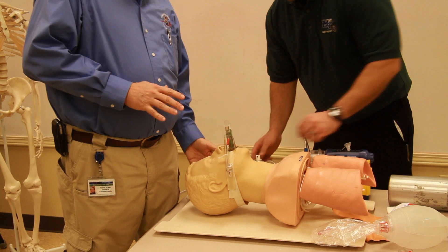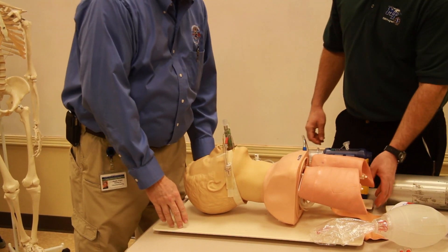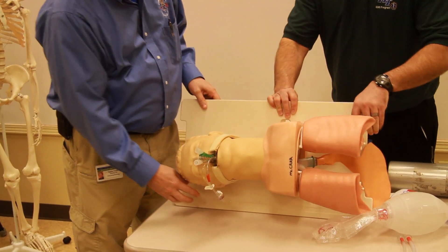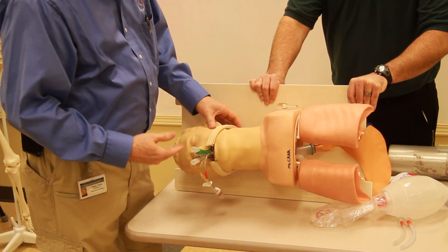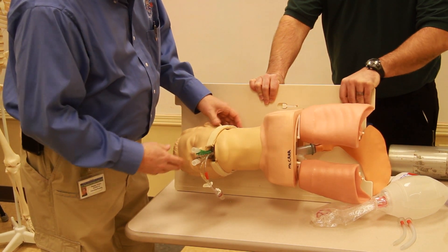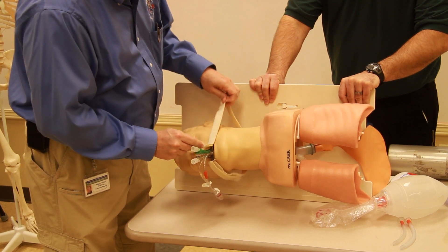My partner brings the suction unit over. We lay the patient on their left side — for the camera we'll lay them on the right side. I explain to the patient what I'm going to do when I remove the airway.